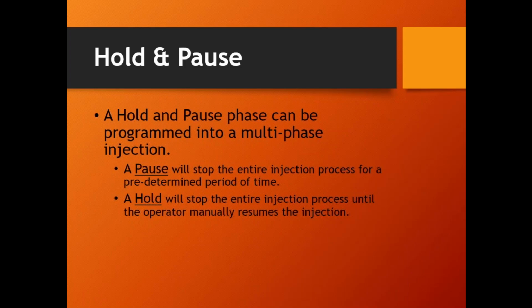Now a pause, people think, well, isn't that the same thing? No, there is a slight difference between the two. A pause is a stoppage of the injection, but for a specified period of time.